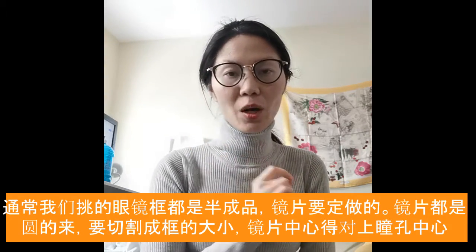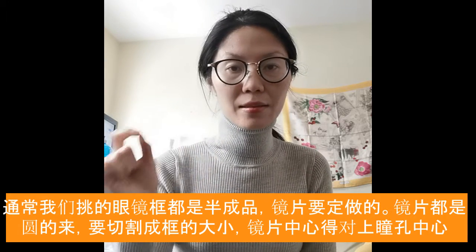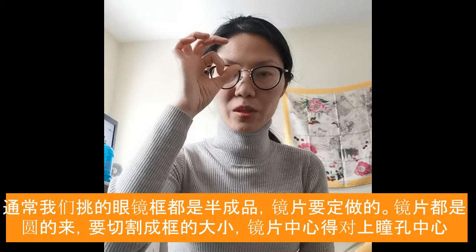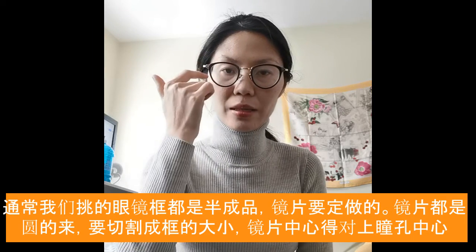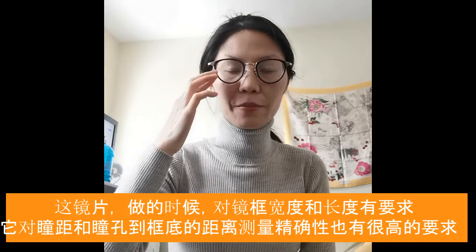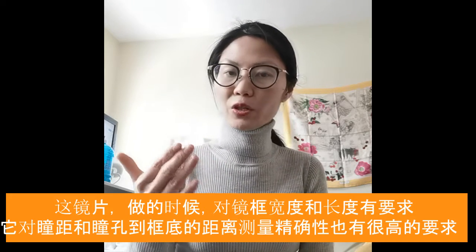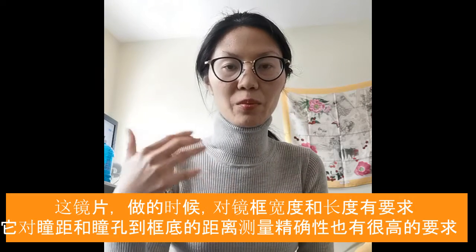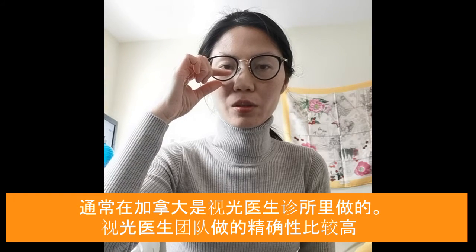It has to be done properly when prescribing and measuring for the glasses and for the pupil center. The lens circle center has to be on the pupil center. When we measure for the PD — the distance between the two pupils — we also need to measure the height specifically to fit the lens properly. This needs to be done professionally at an optometry office where they have the proper equipment and measurements. The height has to be measured properly so that it's not over or under the circle.